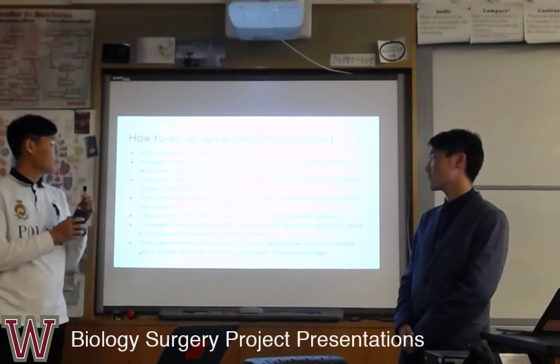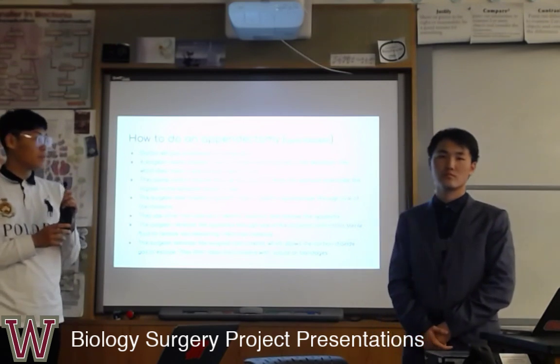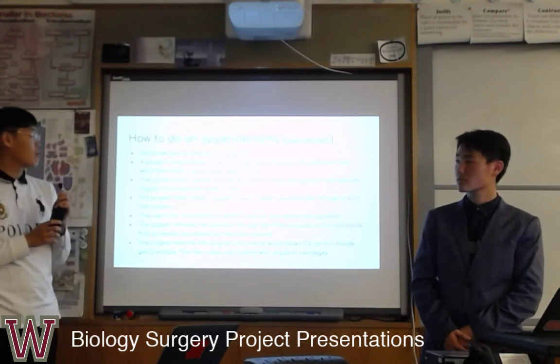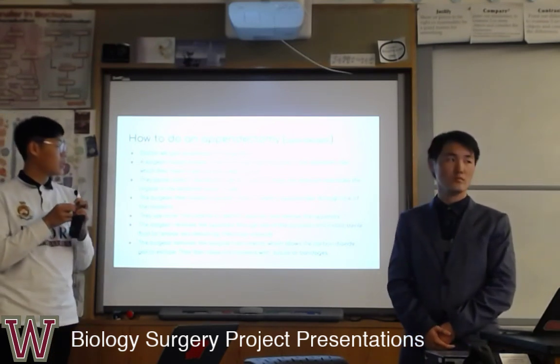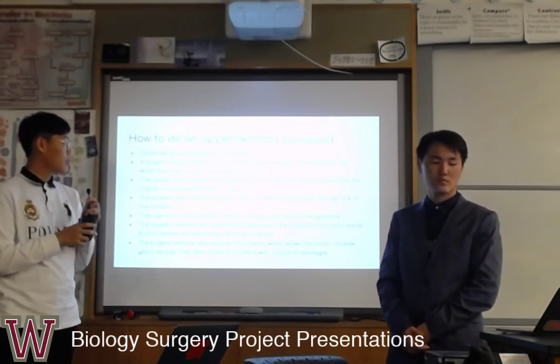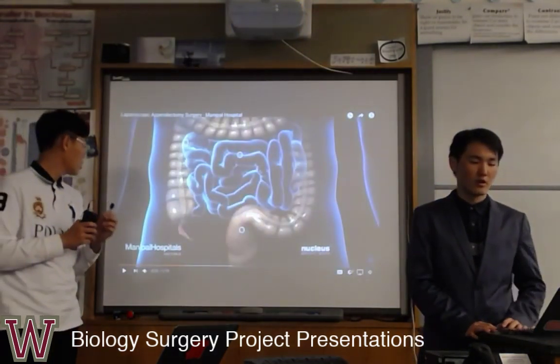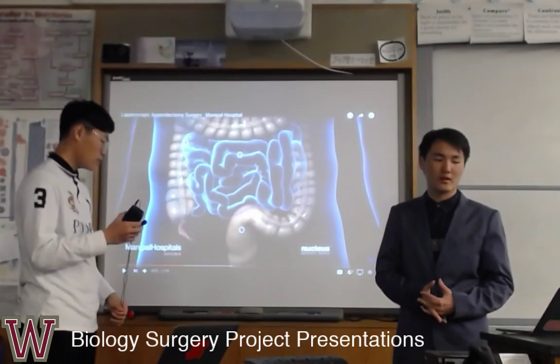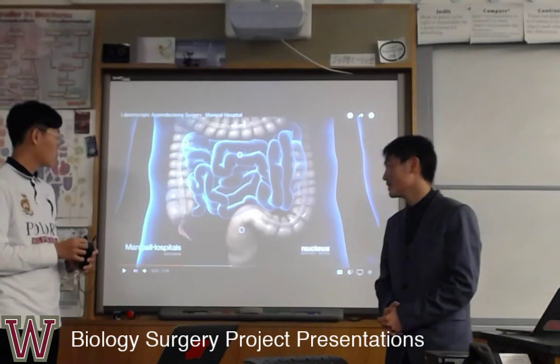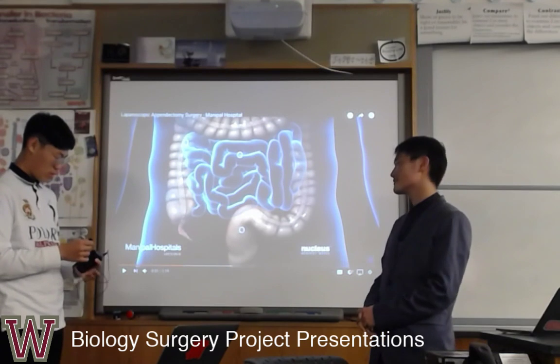Usually, people will choose laparoscopic appendectomy because it's easier and patients can recover faster than with the open appendectomy. And we have a video of laparoscopic appendectomy that we can show you. This is the video we found online. It is a 3D concept to show people more directly what the surgery is.